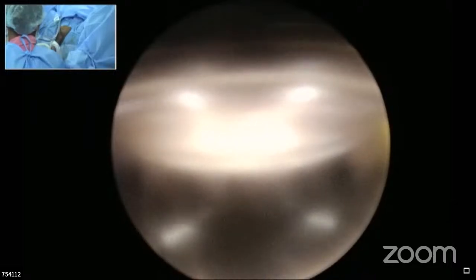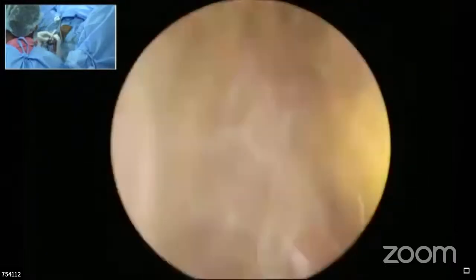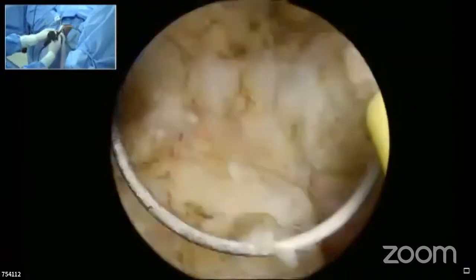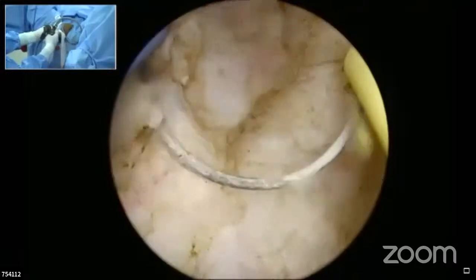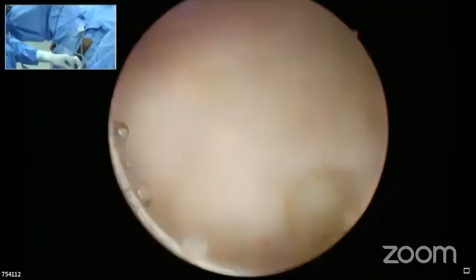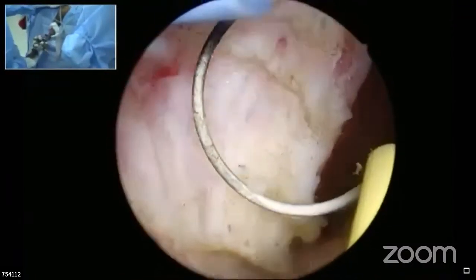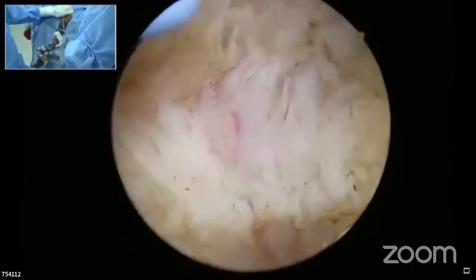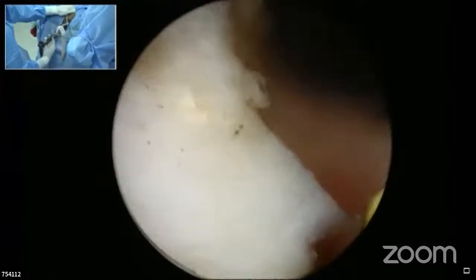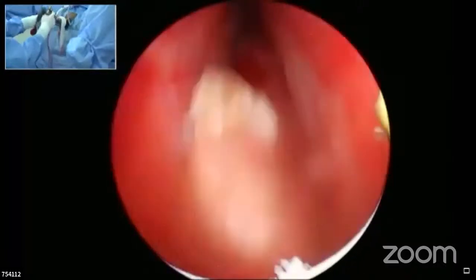Do you resect one lobe completely, including the apex, or do you leave the apical tissue and finish it last? I'll proceed now with the left lobe, sir, and the apex will be at the last. Because for a proper resection of the overhanging apex, debulking of the adenoma is essential, mandatory. Only then, like sir was mentioning, the apex will define itself as to how much tissue is there and where the junction of the tissue with the underlying structures is, and then we can scoop it out. Unless we have proper debulking of the lateral lobes, it would be an inadequate resection of the apical tissue.